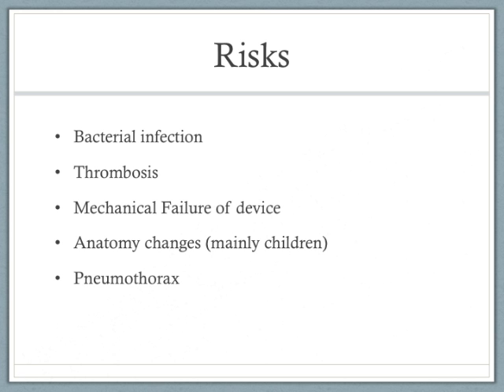Another concern is anatomy changes. This occurs mainly in children as they grow. The placement of the catheter can change as the child grows larger. It can also change depending on how a person's anatomy changes as the disease process affects them.